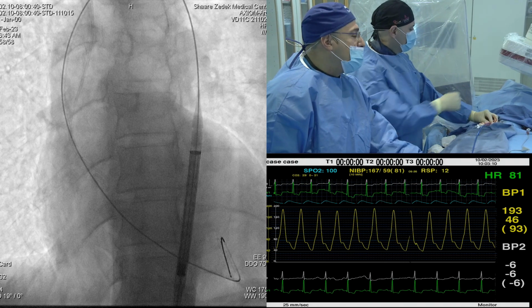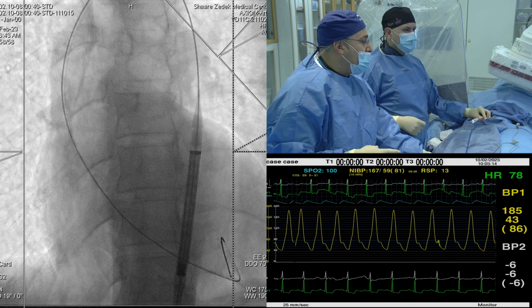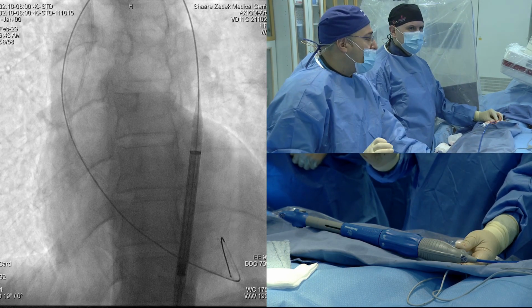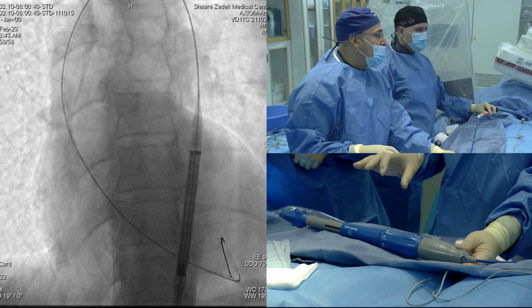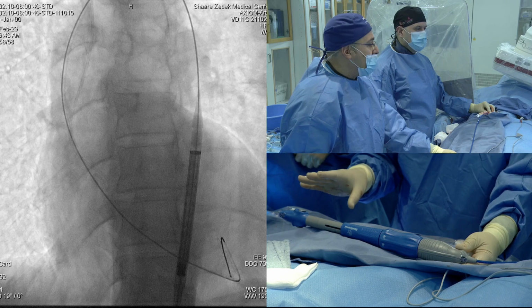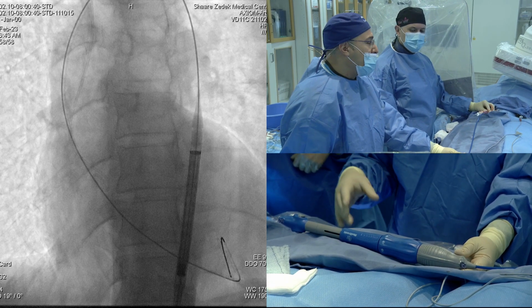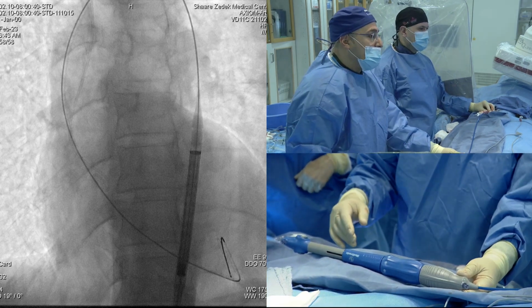In this particular case, since we chose the smaller size device, we want a very high position. A 6 millimeter depth in this type of case would be very bad. We don't want 6 millimeter, and this is another reason to have more control on the implantation. Hopefully this is what we'll get.